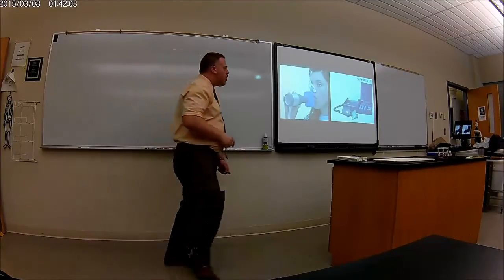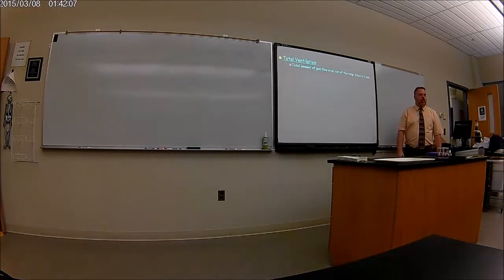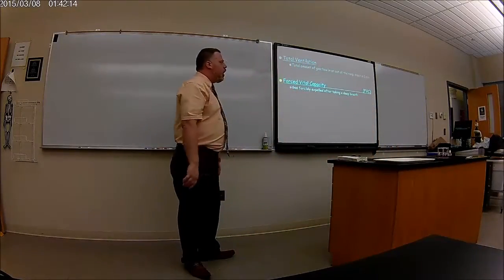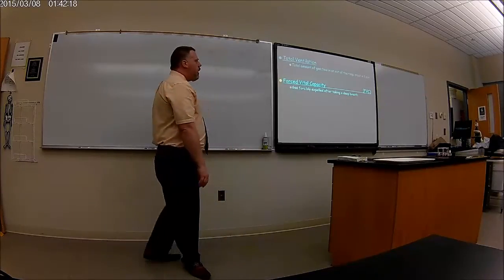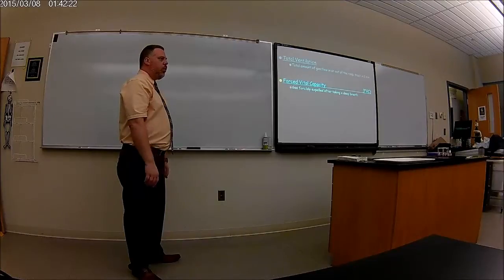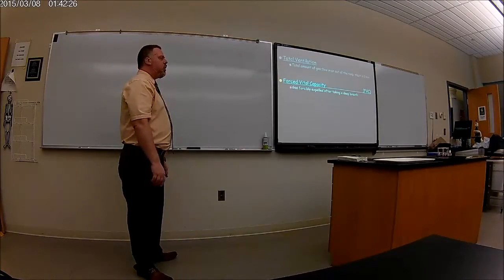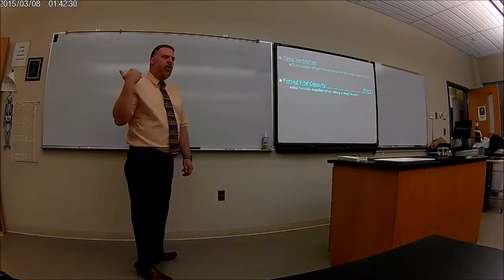Let me get into this, okay? We have total ventilation here, the total amount of air in the respiratory tract in 1 minute. Now we have the forced vital capacity. That's how much of the air you could forcibly take in a deep breath, and then expel. So this is FVC, the amount of air that you could expel out very fast.